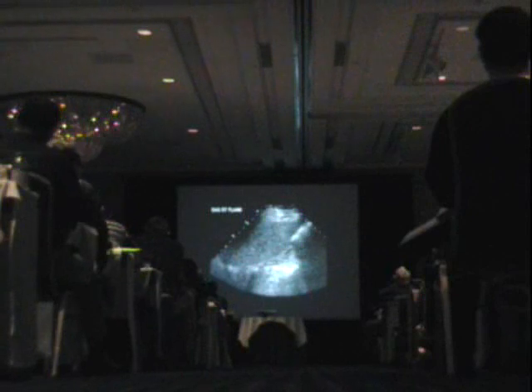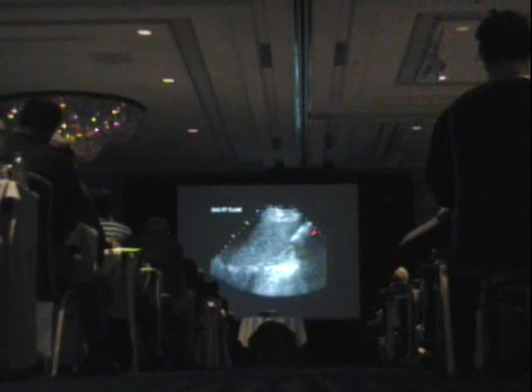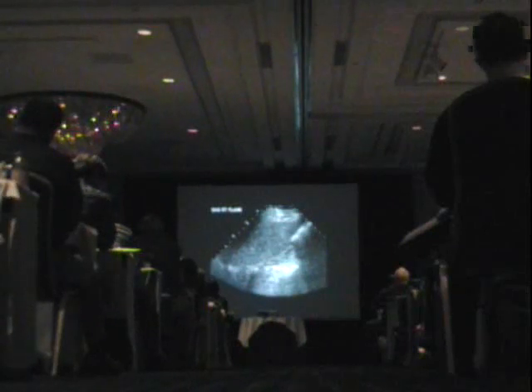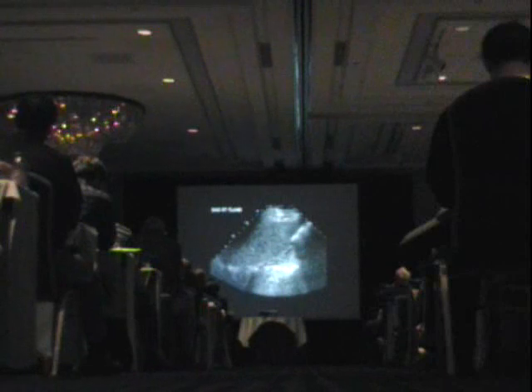And the reason that you need to be concerned about these or be aware of these is in patients who have duplication anomalies of the uterus, it's very common that there are renal anomalies as well. And in this patient, here in the right upper quadrant, we see where there should be a kidney and there indeed is not a kidney. So if you're looking at GYN anomalies and this is a patient who may have surgery for infertility or surgery for a cyst, you do want to make sure that the referring clinician knows that there's only one kidney in that patient.